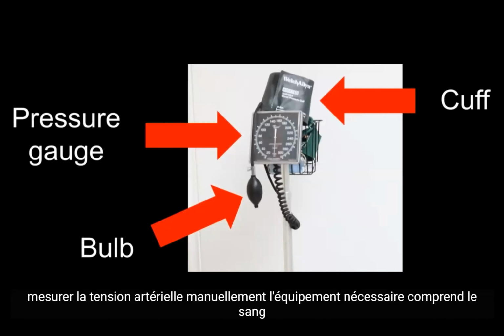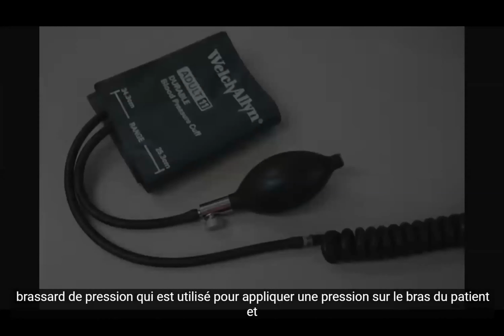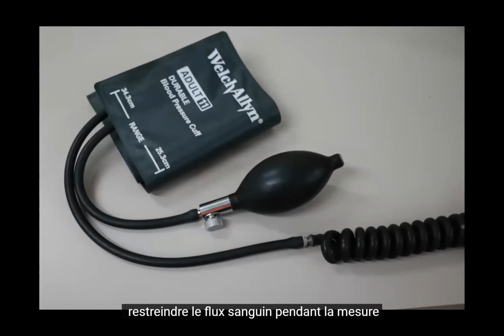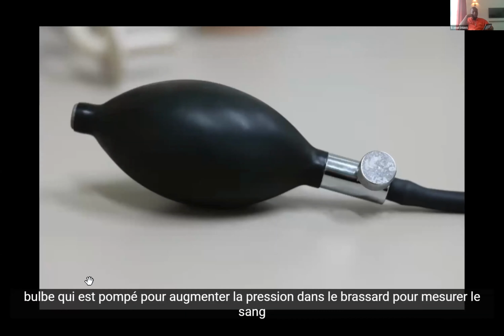Necessary equipment includes the blood pressure cuff, which is used to apply pressure to the patient's arm and restrict blood flow during the measurement; the manometer gauge, which shows the current pressure in the cuff; and the bulb, which is pumped to increase pressure in the cuff.